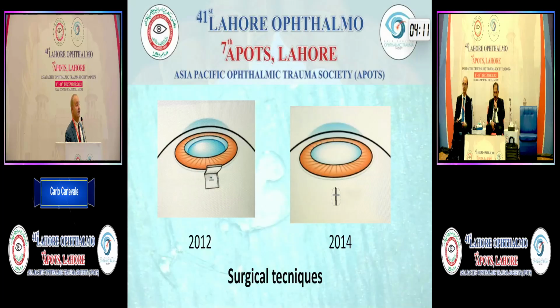How to implant this lens? There are two basic procedures and many variations. We can make a 4x4 flap and then bury the plug in this scleral flap.